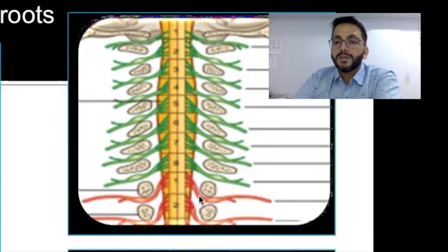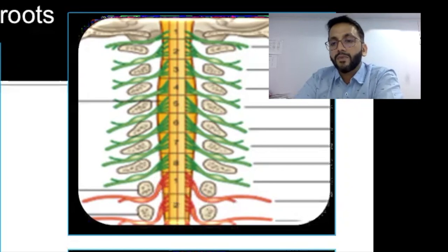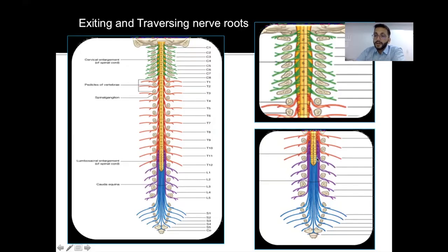This is the traversing part of the nerve, and this is the exiting part. We have both traversing and exiting nerves in the dorsal and lumbar spine, but this is not the case in the cervical spine. When we look at disc herniations, a paracentral disc causes compression of the traversing nerve, while a far lateral disc causes compression of the exiting nerve in the neural foramen.